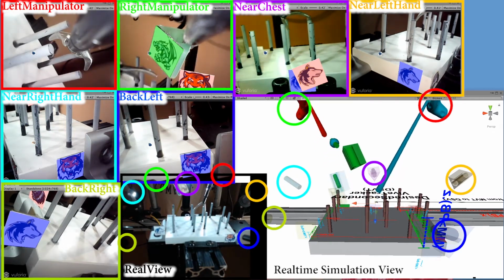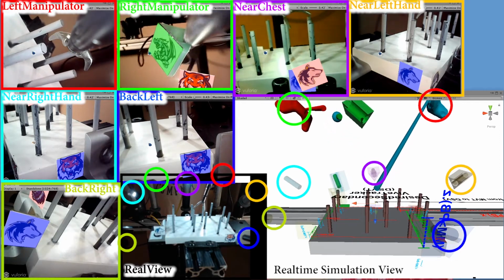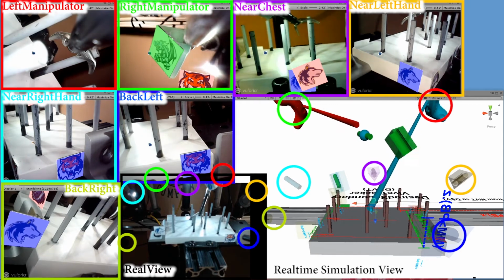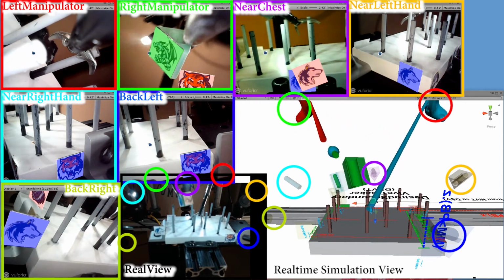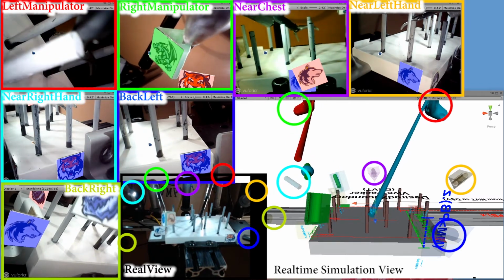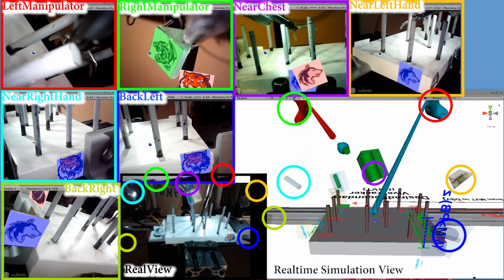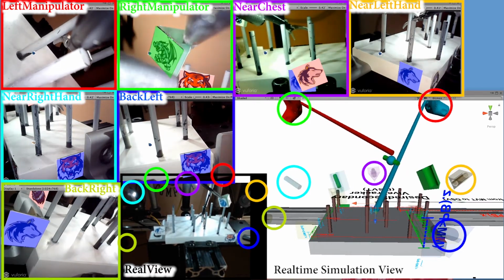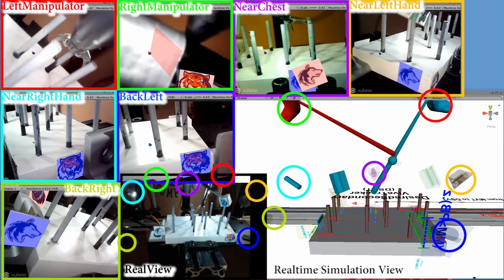But what this video is, well, I tried a couple of things throughout this video. I tried just moving it between different camera views. Right now, what I was testing was I was trying to show that the tracking is reasonably accurate, or maybe not accurate. I can't really test if it's accurate or not, but I just wanted to show that I meet the intended goal of the dynamic manipulators, which is to be able to track the cube when it's not visible by any of the side cameras.